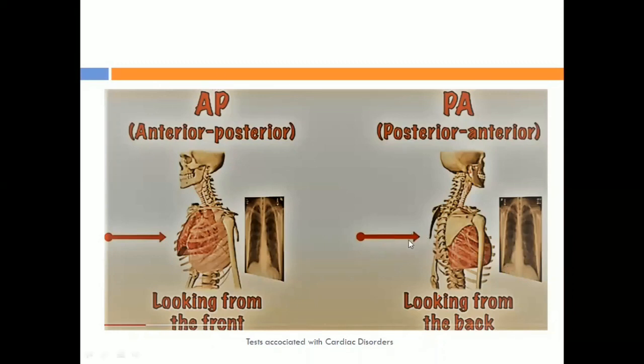And this one, if the photons are passing through starting from the back of the person, from the back side, that is the posterior anterior view. So you just have to remember, AP means anterior posterior and PA means posterior anterior.